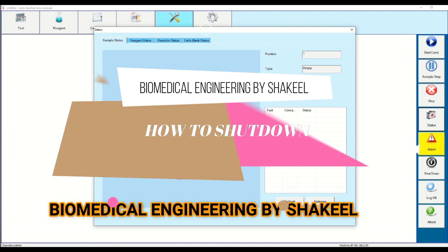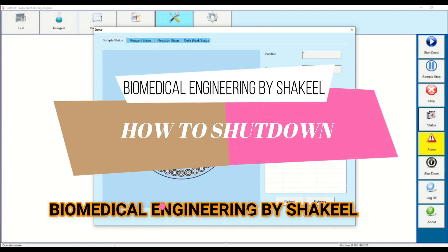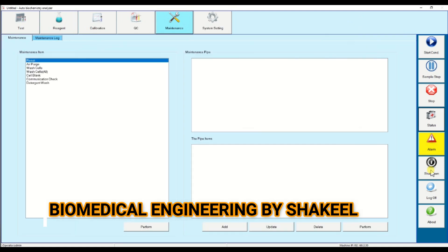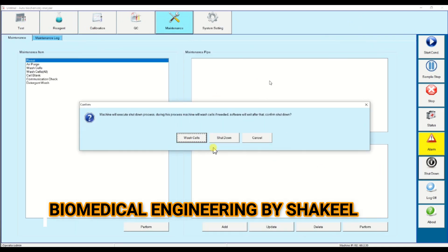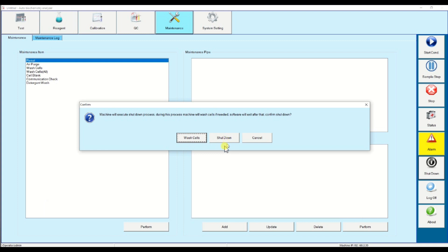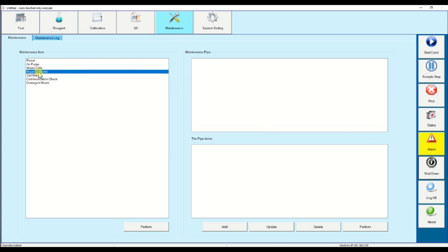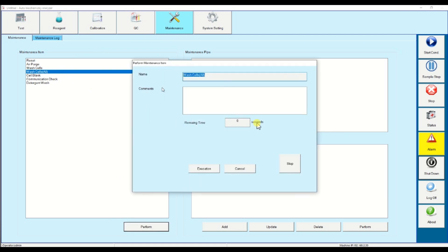Now I will tell you how to shut down this analyzer. Before shutdown, be sure you clean the cuvettes. Click on shutdown — you will see three options: wash cell, shutdown, and cancel. Always click on wash cell to clean all the cuvettes before shutting down the machine. You can also go to maintenance and click wash cell all. After that you can shut down the analyzer.